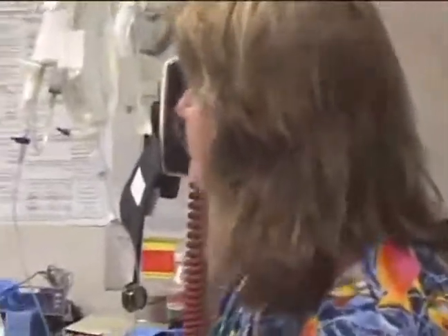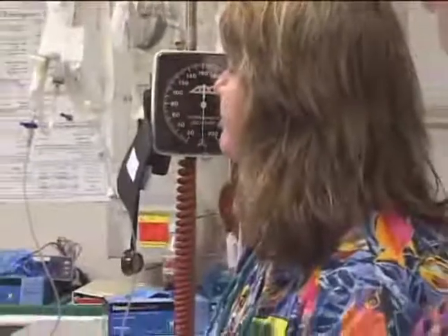When we put somebody on a ventilator, what do we usually put them on in here? You said it can be a rate of 8 to 10, tidal volume 700, 100%, generally people fine. Okay, so you can kind of preset your ventilator for that. Always be thinking that. Perfect.